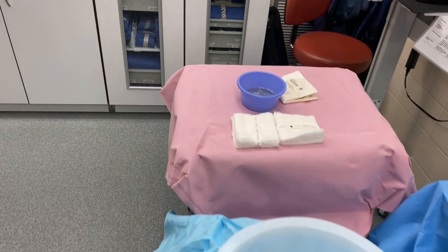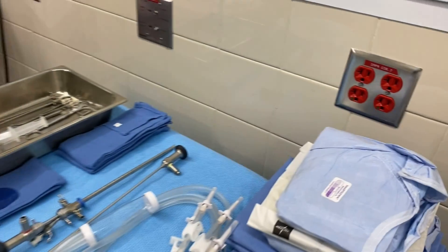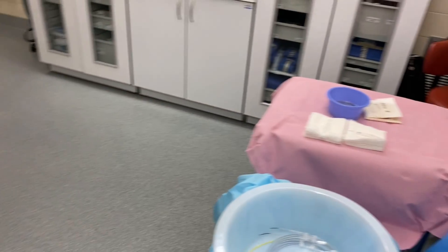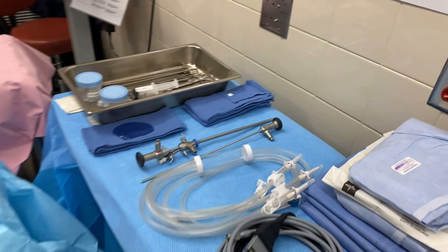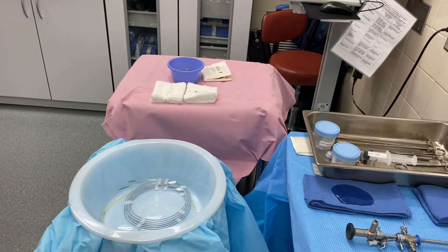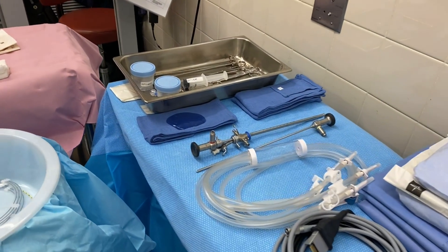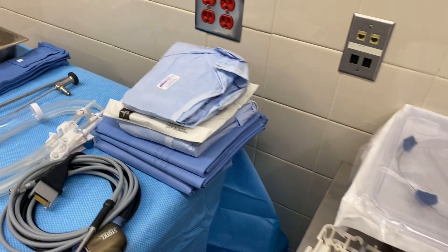It's your boy the surgical guru and I wanted to bring you another video. This is a setup for a cystoscopy. We're going to run through this real quick because we don't need too much stuff. One thing I love about cysto is that I don't have to set up with a full gown and gloves — well, I do set up with gloves but not a whole gown and glove setup. You just throw your gloves on, do an open gloving technique, and put this together.